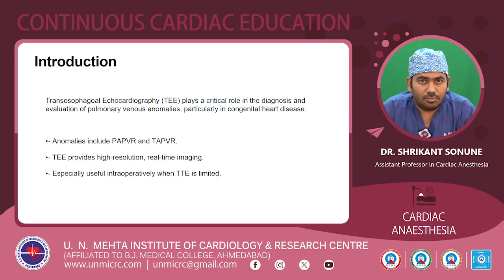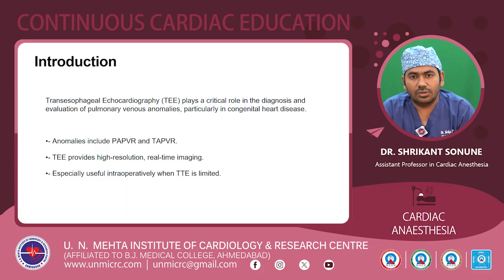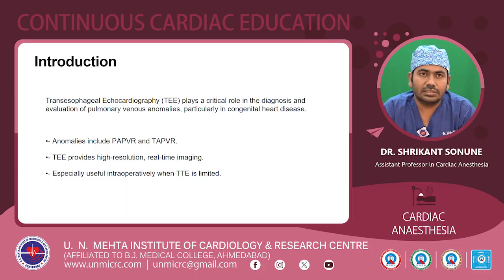Coming to the introduction part, the transesophageal echo plays a critical role in diagnosis and evaluation of pulmonary venous abnormalities, particularly in congenital heart disease. These anomalies include anomalous pulmonary venous return or TAPVR, and TEE provides high resolution and real-time imaging, especially used intraoperatively when the transthoracic echo has limited access.